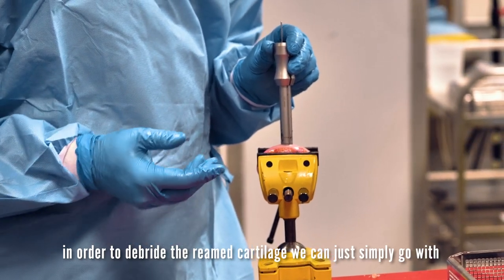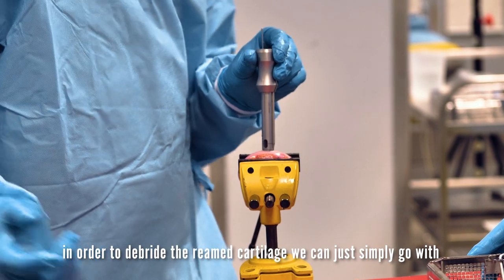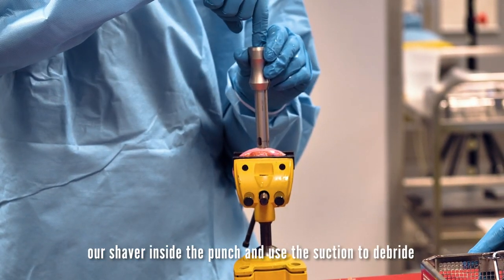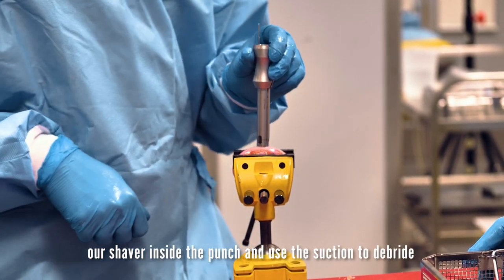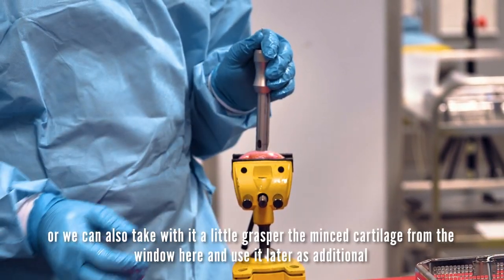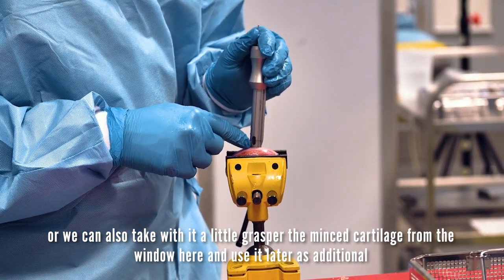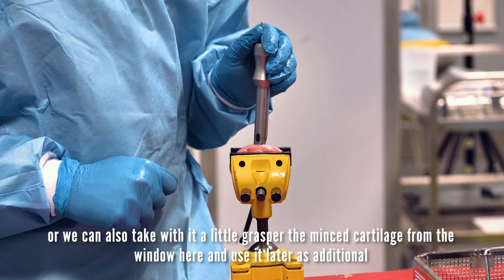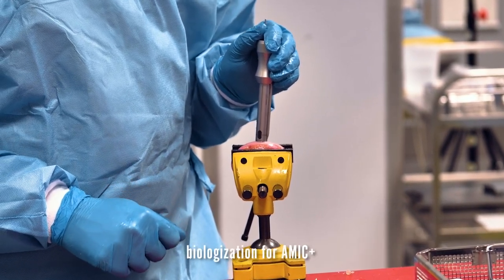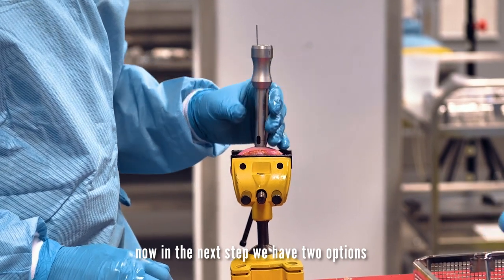In order to debride the reamed cartilage, we can simply go with our shaver inside the punch and use the suction to debride it. Or we can also take with a small grasper the minced cartilage from the window here and use it later as additional biologization for AMIC+. Now in the next step we have two options.